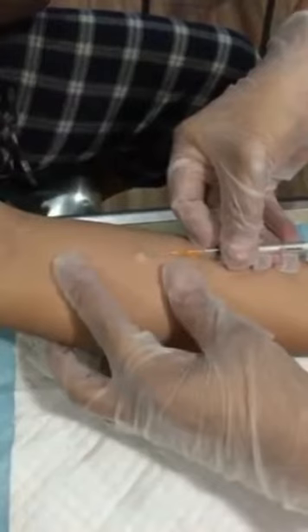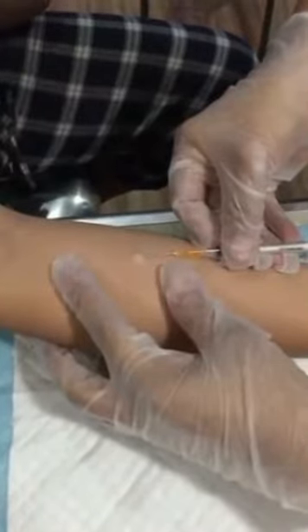Insert the tip of the needle far enough to place the bevel through the epidermis into the dermis. The outline of the bevel should be visible under the skin surface. Stabilize the syringe and needle. Inject the medication carefully and slowly so that it produces a small wheal on the skin. This verifies that the medication entered the dermis.